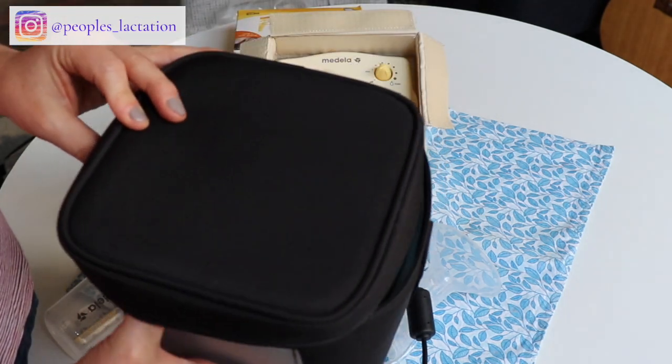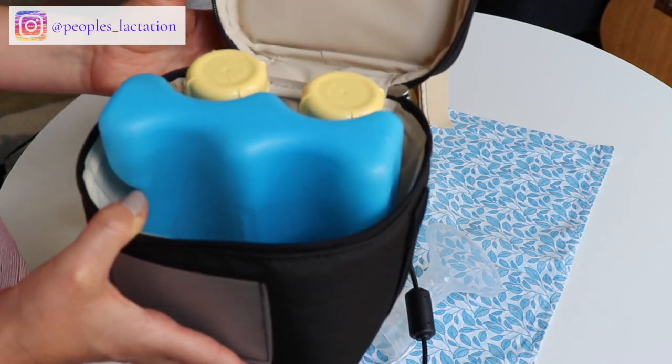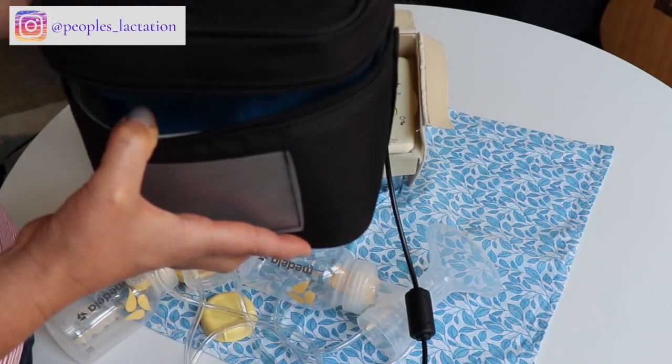Some Medela pumps also come with a little cooler and a bottle holder, which can be super convenient for pumping on the go. You can just put your bottles in here for up to four hours and you're good to go.